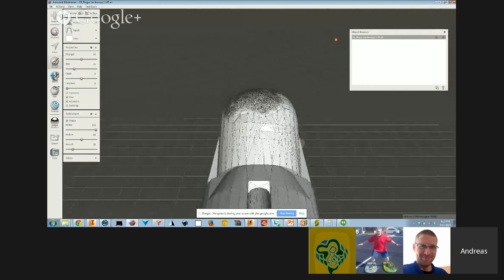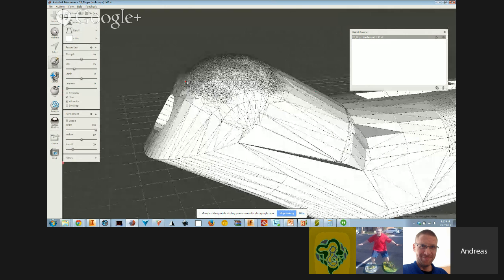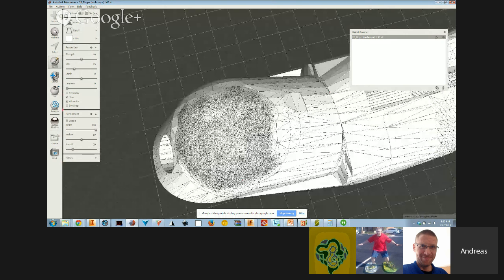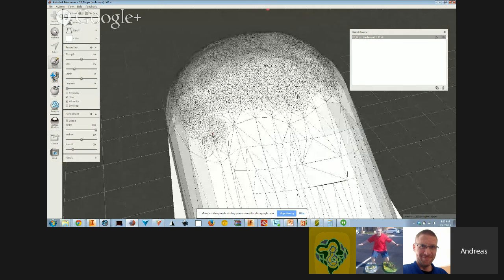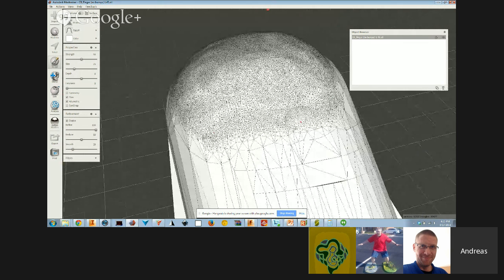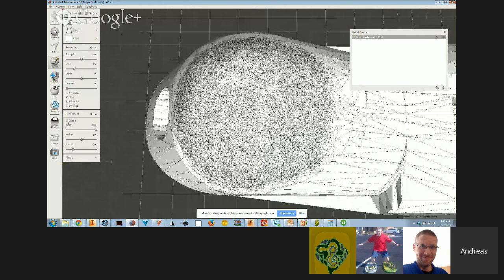You can get some unexpected behavior when you start to go around corners and whatnot, but for this I could use this. There's also a remesh algorithm that I might use if I want to do the whole object, with more settings to adapt to the existing geometry. But in this case, I'm going to make sure I don't have reduce on, and whenever I am in a sculpt tool, I have this refinement option, and I'm trying to add triangles. So I'm going to bump up refine and reduce, so to speak.